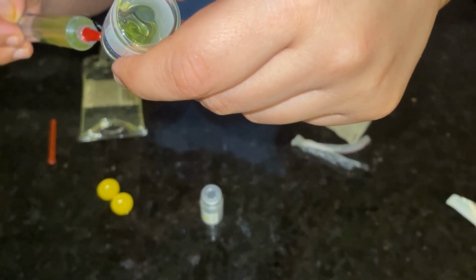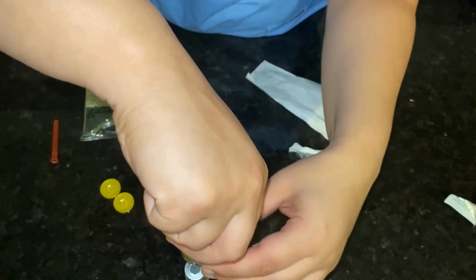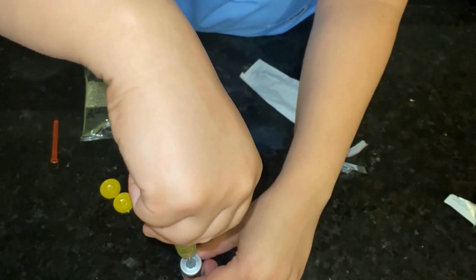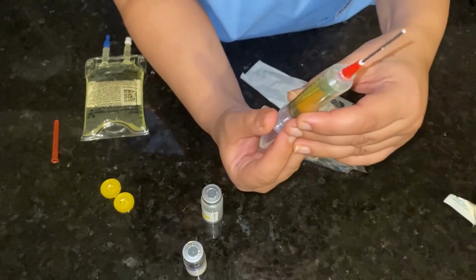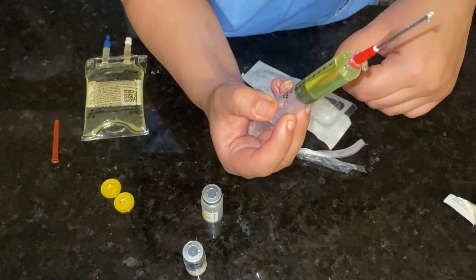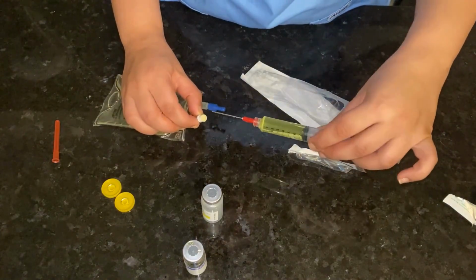Okay, we need a little more. Perfect. Because of the negative pressure, it may spray a little. We try not to. Okay. It should be 7.5. And I sterilize the top part. I have to add this to my piggyback.